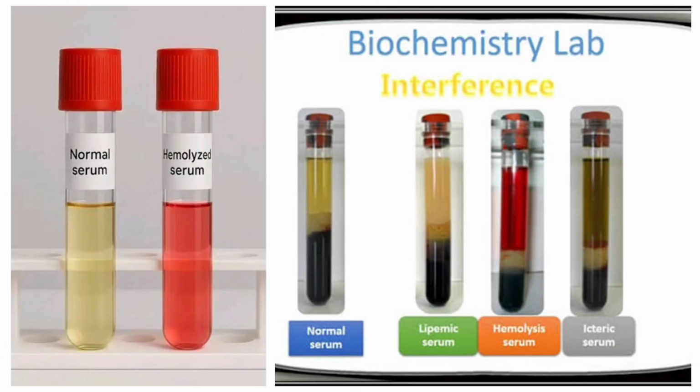So anything that the analyzer is measuring, the comfort zone of the analyzer, the detection and measuring ranges, the sensitivity of the analyzer, has been zeroed to measure something that is normal serum or plasma. Does that make sense? Okay. It means that anything outside of normal serum or plasma would interfere with the sensitivity of that measuring range, and therefore may give you a false result, a false negative or false positive result.